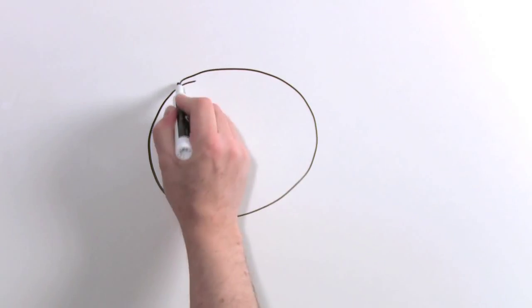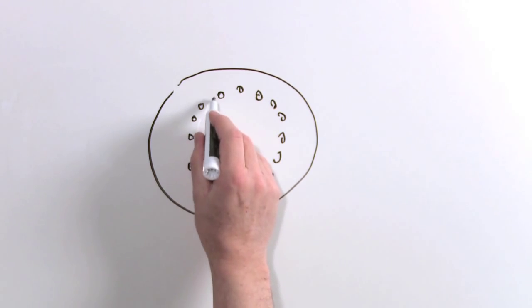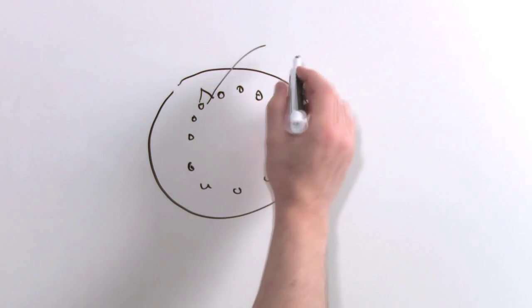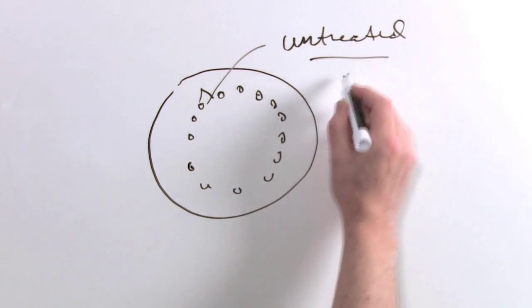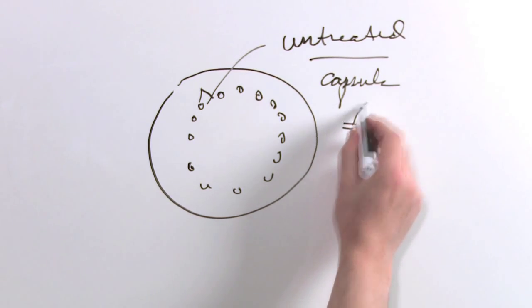Once again, if you see the visible part of the lens during surgery, you can see bubbles created where the laser is firing on the anterior capsule. However, if you show a big gap in this area, this will tend to be untreated capsule and this will be the postage stamp adhesion with a weak spot in the capsular opening.